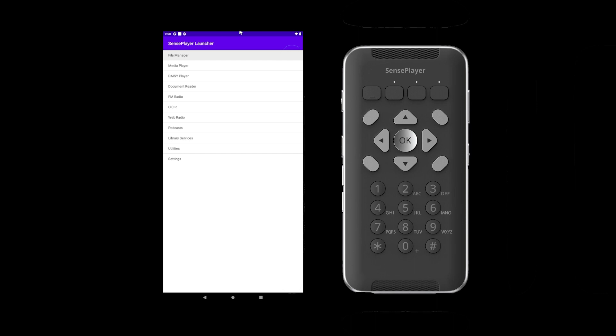To open OCR, begin on the home screen by pressing the home button. Next, scroll to OCR by pressing the down arrow five times. Then open OCR by pressing OK.